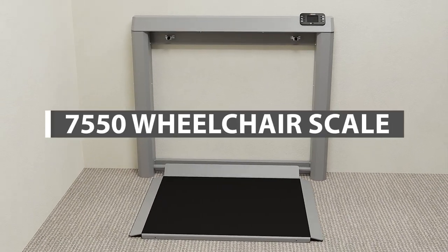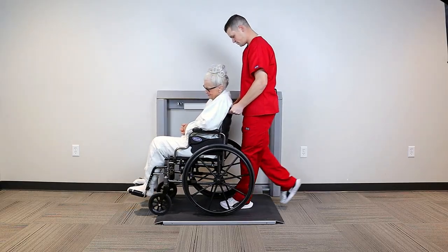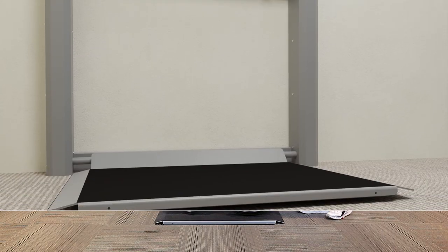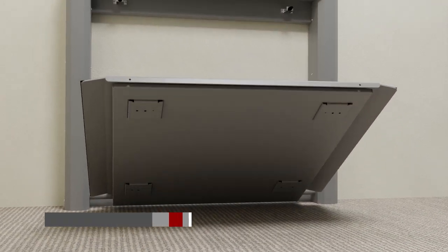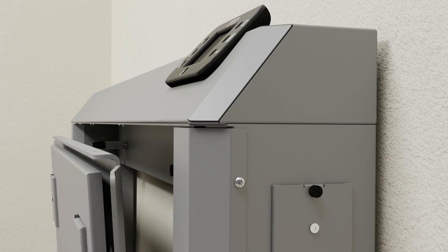Detecto's model 7550 wheelchair scale features a unique fold-up storage design that conserves space when not in use. You can install the 7550 directly in high traffic areas and fold it up easily when done weighing.